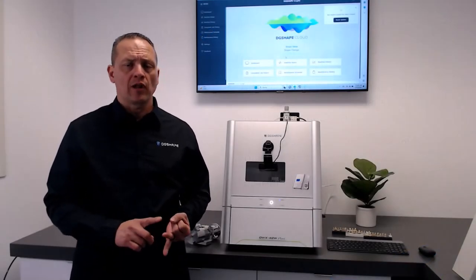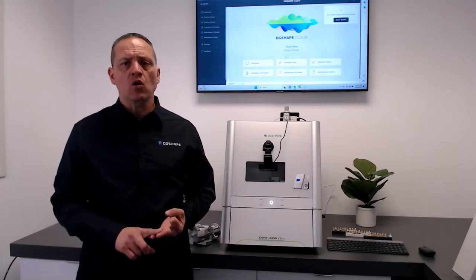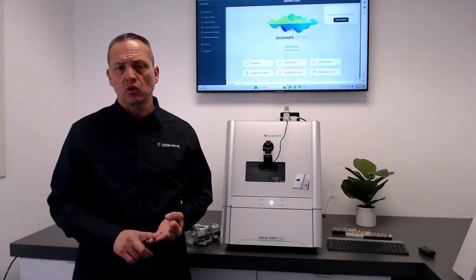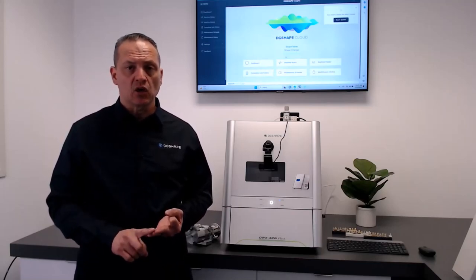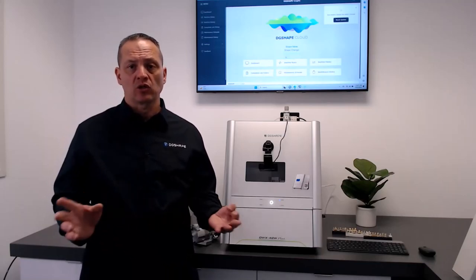It's affordable, reliable, high-quality milling solutions for clinicians, DSOs, and laboratories of all sizes.